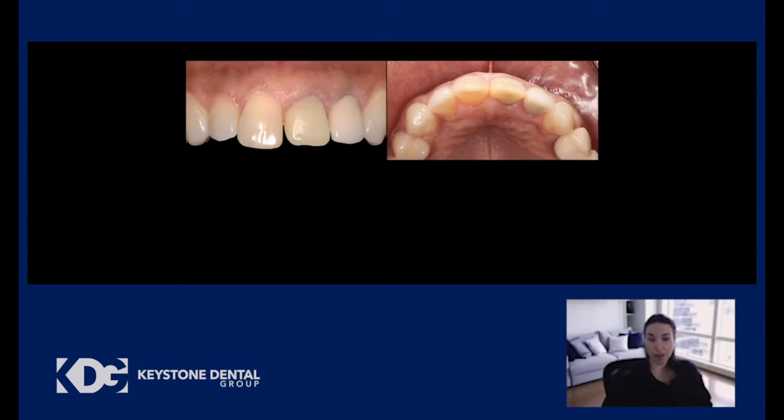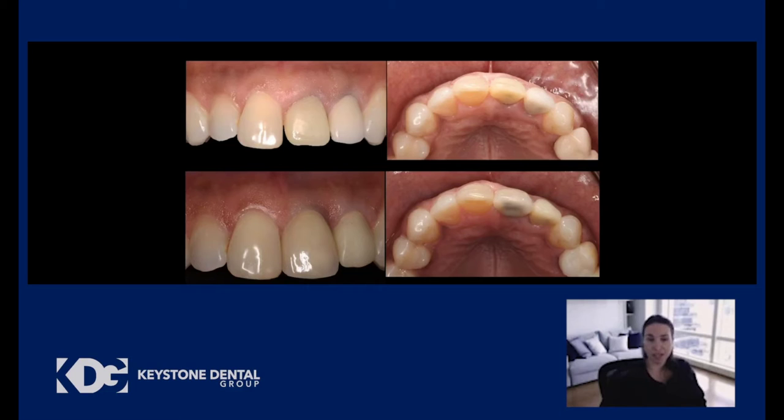The next aspect about the available bone will be the facial-lingual contour of the bone and, again, the soft tissue. So we very commonly see this. This is a case where you can see number 9 is to be extracted. You can see in the occlusal view how much soft tissue we have. And then after the implant is placed and the tissue heals, very commonly we see this sort of concavity, this collapse of the facial bone. So that is definitely a challenge. It will be one of the variables in the pink esthetic score that we are not achieving in this case. We are achieving the level of the papilla, we're achieving the texture of the soft tissue. However, we're not achieving the alveolar process. We're seeing a collapse.